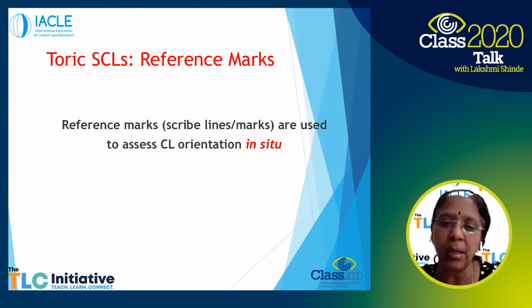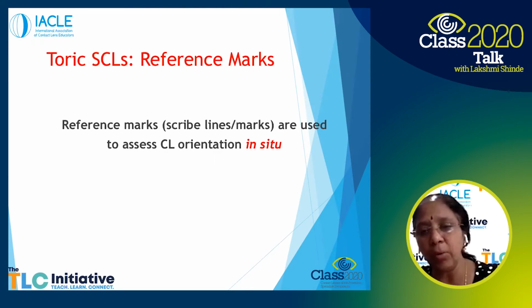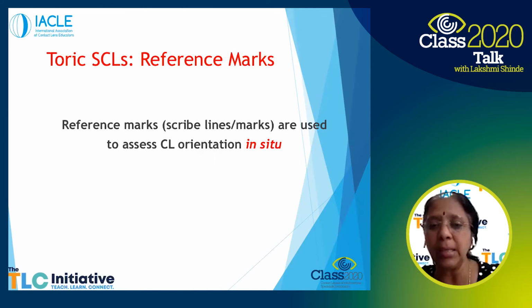They were thicker lenses. So lenses being thicker, they did move on the eye. At the same time, they had to look at stabilization techniques and things like that. But with all the innovation that's happened in terms of materials and stabilization techniques, you hardly get to see that much of contact lens rotation.